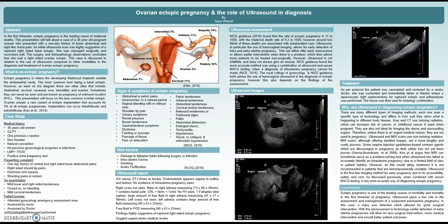The Royal College of Gynecology and NICE Guidance both advise the use of transvaginal ultrasound in the diagnosis of ectopic pregnancy. However, this also depends on the findings of the assessments. Due to the gestation and patient symptoms, it was determined that a transvaginal scan was the most appropriate to assess this pregnancy. The ultrasound scan was performed gaining consent from the patient and adhering to local infection control policy.